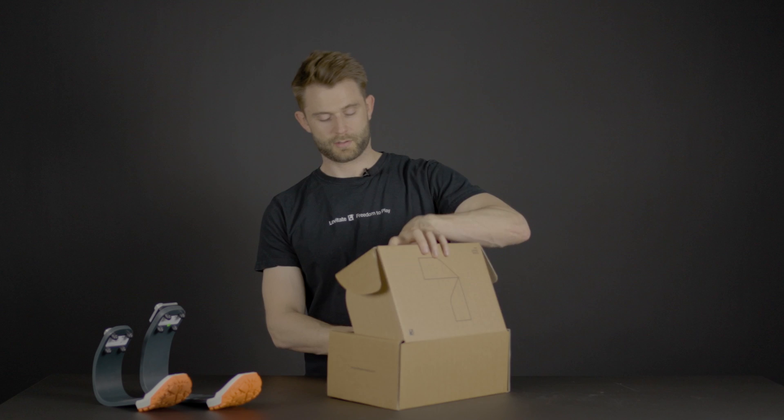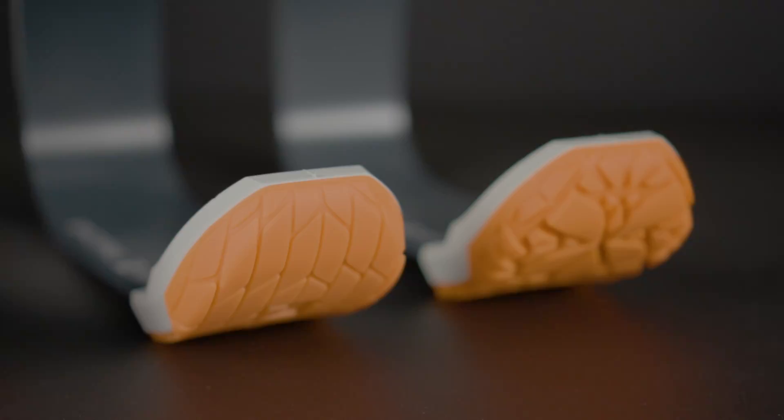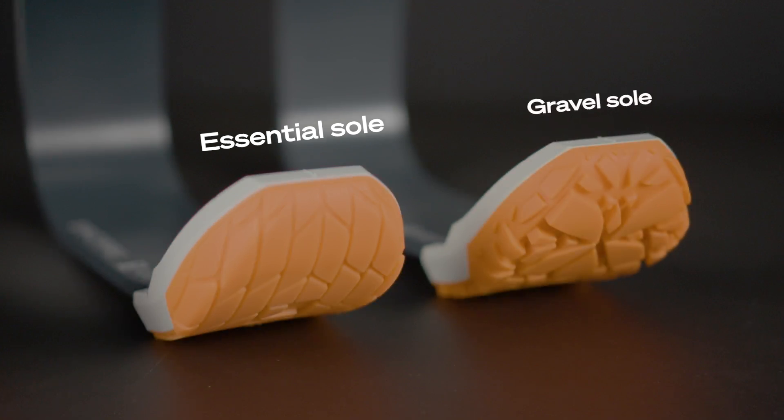In this kit, you will find either one of the two sizes of running blades, the height adjustability, and the tools and guides to install your running blade to your existing setup. When you open up the box, you will find the QR code that you need with the installation guide. You'll also find your new fiberglass running blade with an essential sole. The essential sole is good for everyday activity, but we also have a gravel sole that is good for outdoor use, traction and dirt runs.